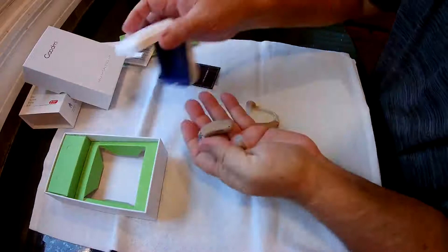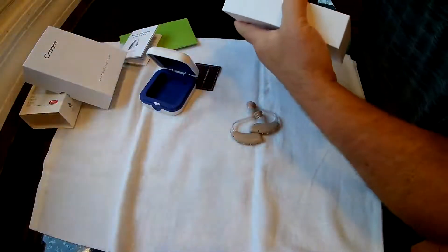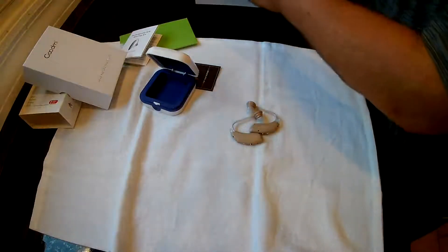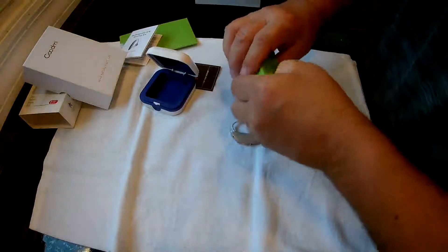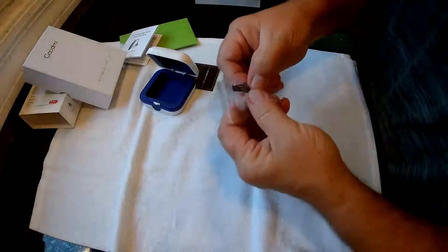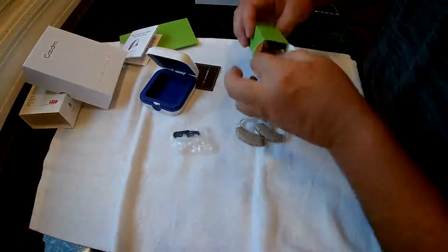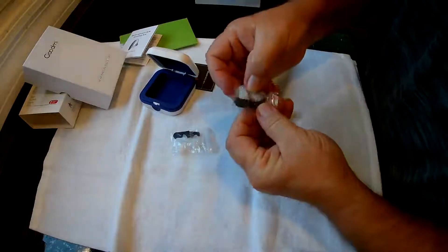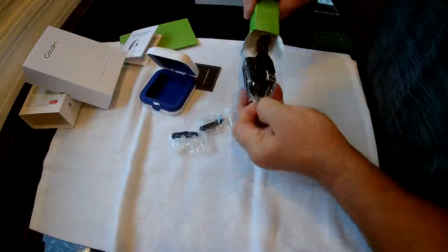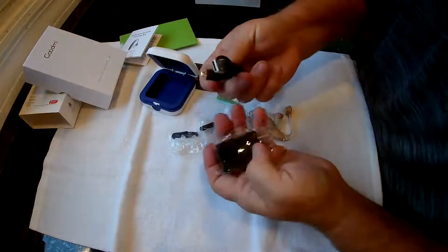Both hearing aids are exactly the same. In the box you should also have your charging cables and earbuds, plus a little cleaning brush. They do come with different size earbuds.